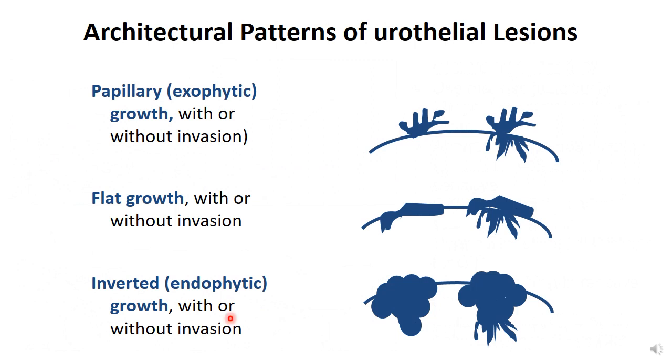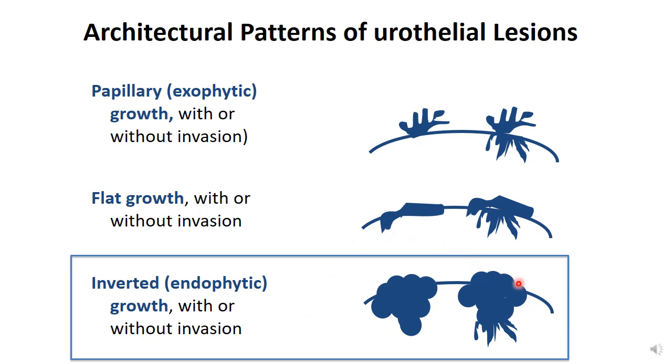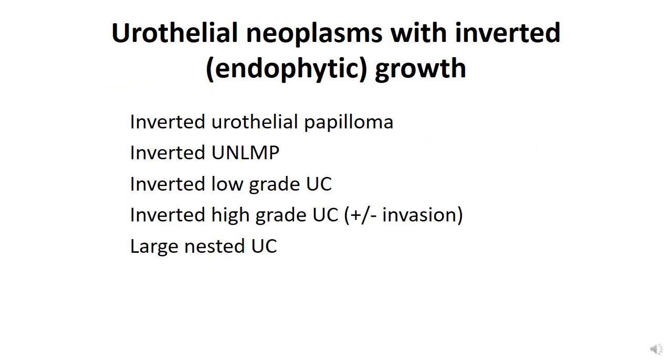The next important process is inverted growth pattern. Again, it can be non-invasive and invasive. And this particular growth pattern is the one which causes most difficulty to distinguish from invasive process. So I will emphasize the invasion question for this particular process as well.